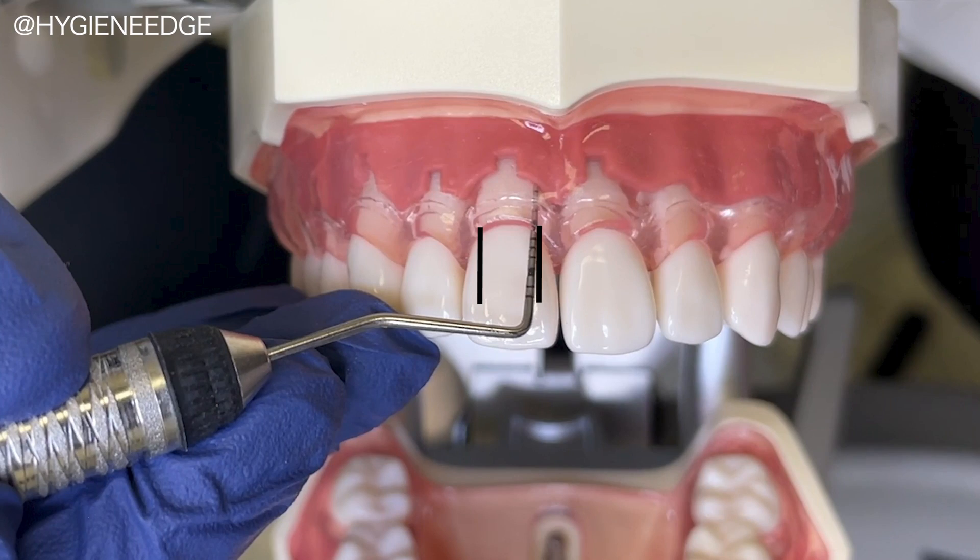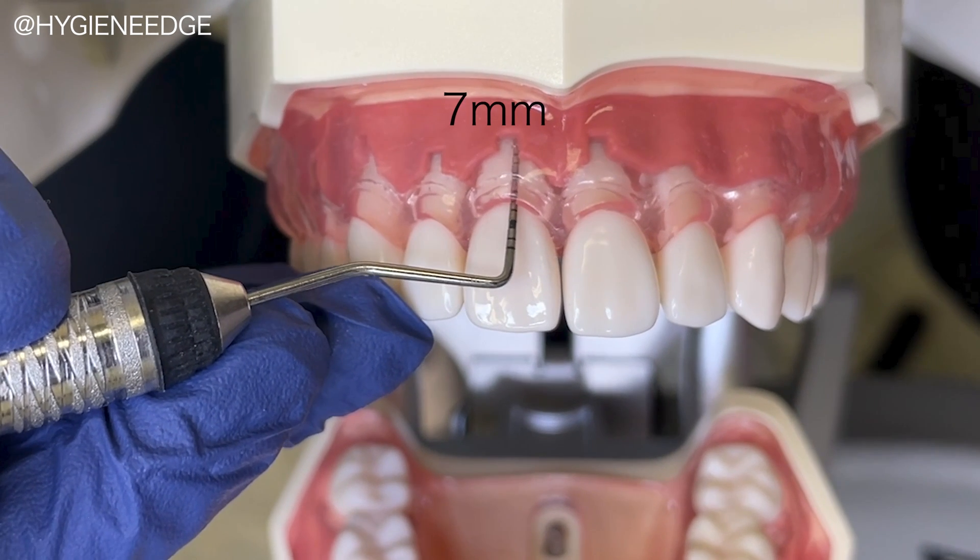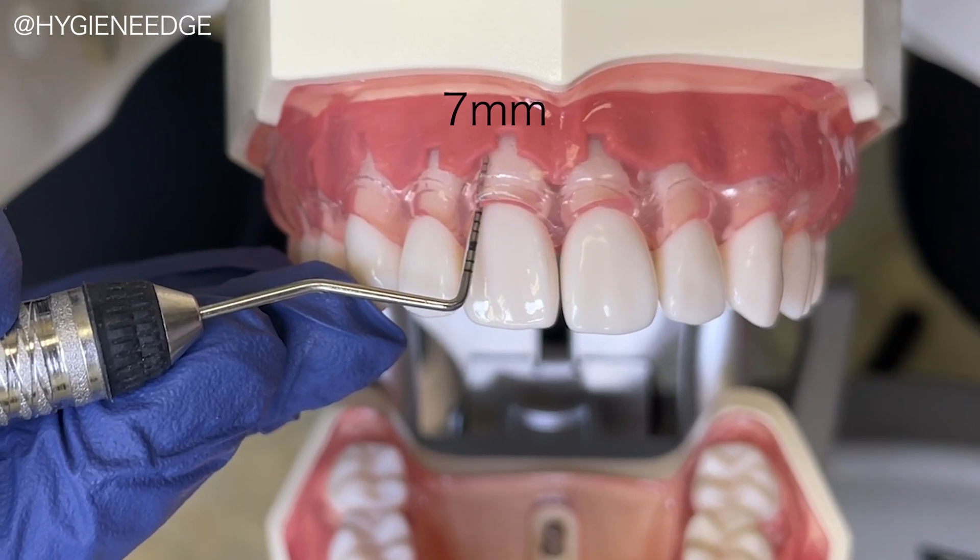Reminder that you will take the deepest reading from line angle to line angle. So if it's a 5 near the line angle but a 7 on the straight buccal, then you would document the 7.